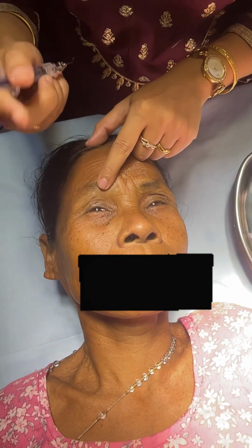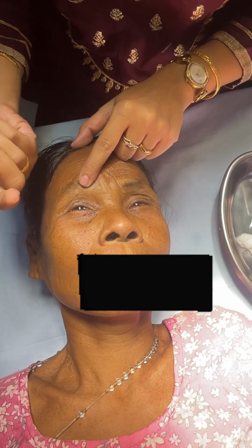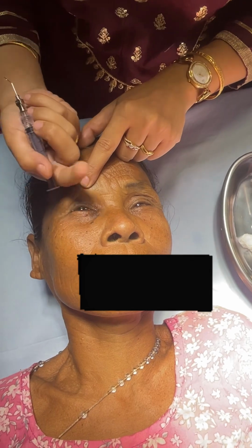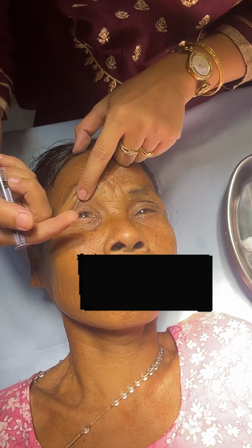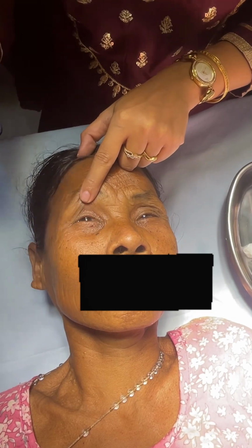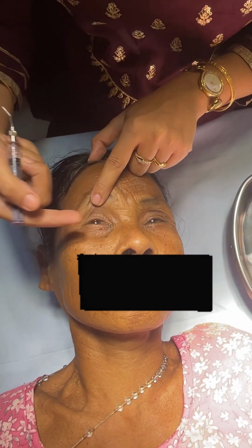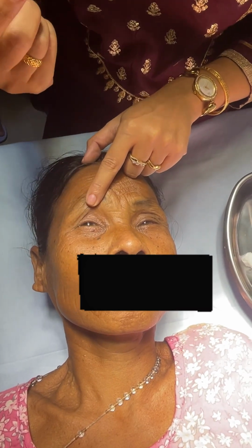But if there had been some blockage, then what would have happened? There might have been regurgitation. Now you have to check from which punctum the regurgitation comes, from the upper punctum or sometimes from the same punctum. When it comes out from the superior punctum, that will give a different diagnosis. When it comes from the same punctum, that will give a different diagnosis. Okay.